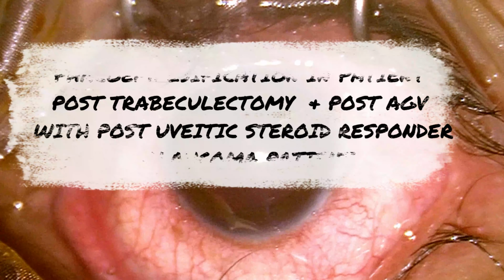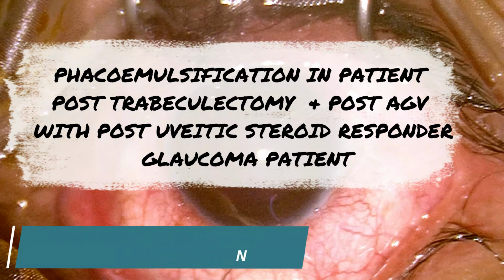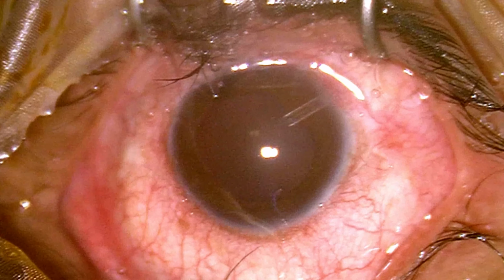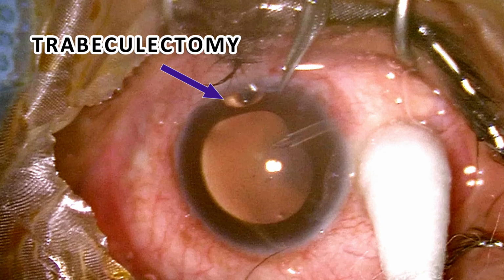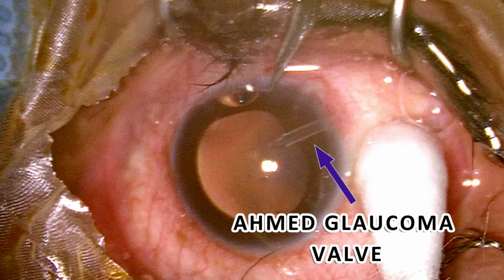Welcome everyone. Today we will be seeing phacoemulsification in a patient who has undergone trabeculectomy and Ahmed glaucoma valve implantation due to secondary glaucoma post uveitis, and the patient is also a steroid responder. Let's start with the case.